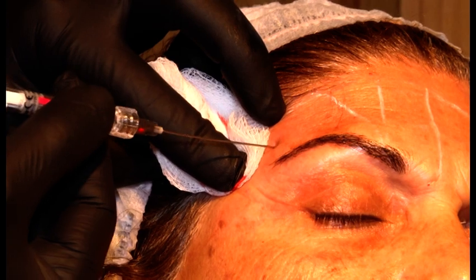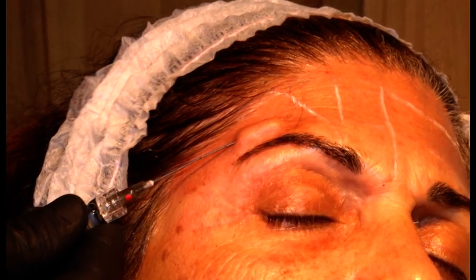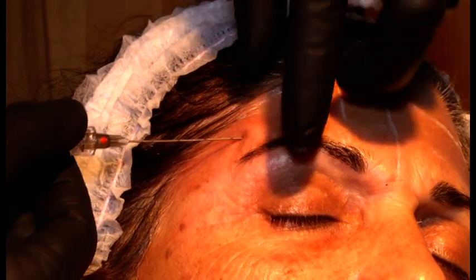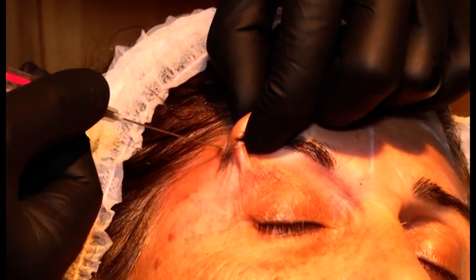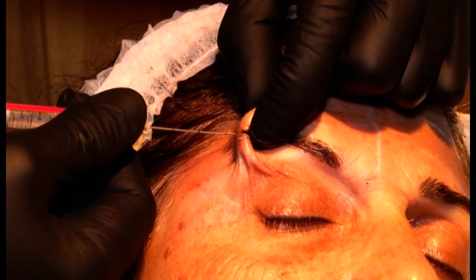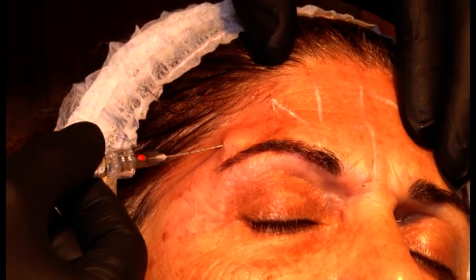Let me find this entry point. Here we go. So, I'm subcutaneous, it's too superficial. See, if I pull up, it looks like this. So I want to go below the muscle, so I lift up the galea, I lift up the muscle, and I feel the resistance of the galea. I rotate and I press through. I feel a click. Now the cannula is on periosteum, and I feel that.